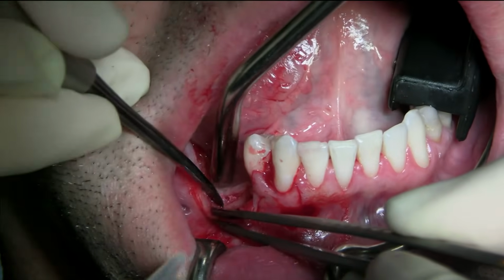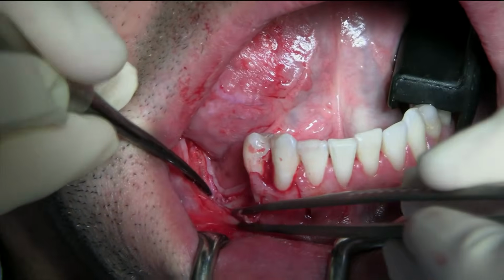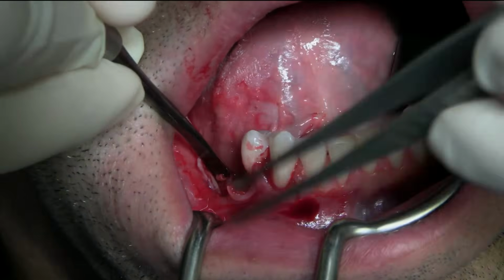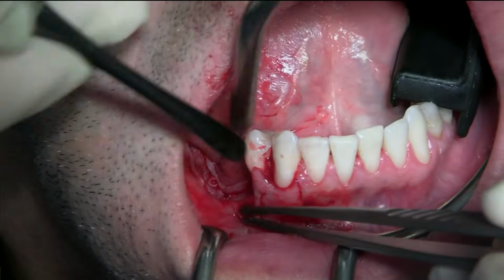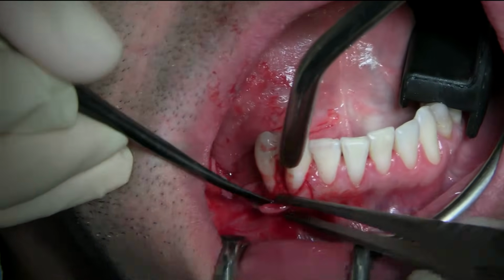You might have it now. Yeah, got it. Okay, so my stumbling block was just the area where the old implant was, because I got all that soft tissue to invaginate. So now we're going to continue.